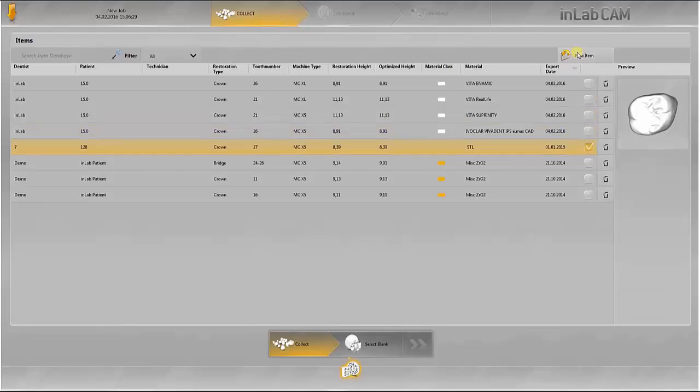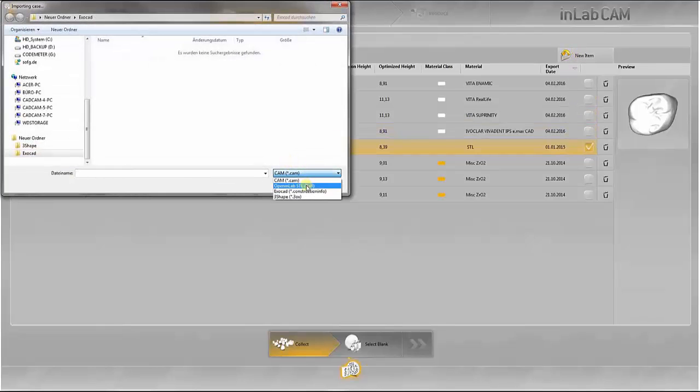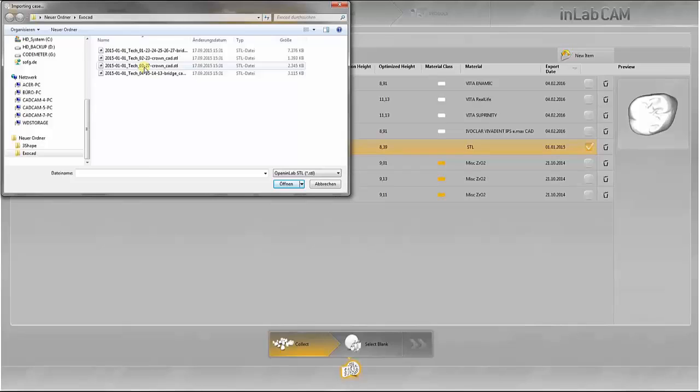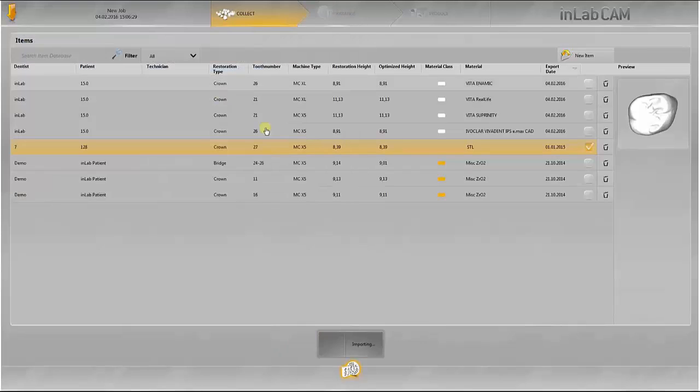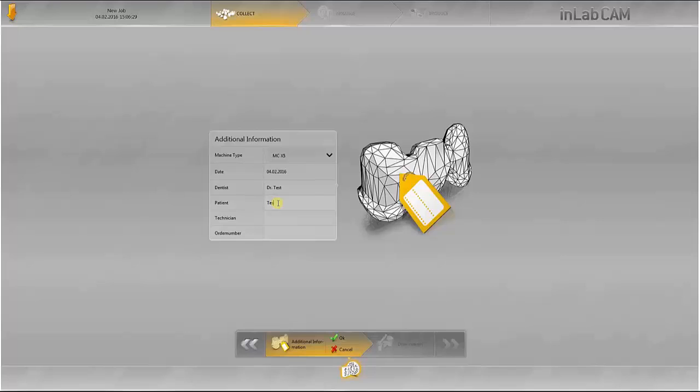STL data without a margin line can also be integrated into the InLab CAM software. The necessary additional information must be added manually since this is not supplied. You can name the dentist, the patient, the dental technician, and assign a job number.